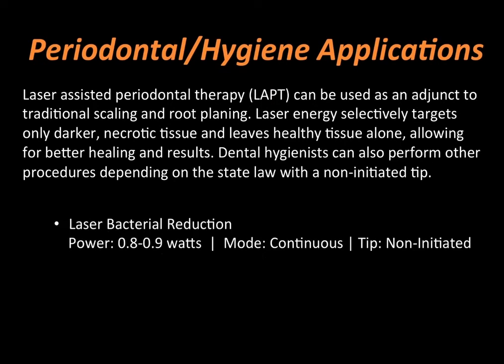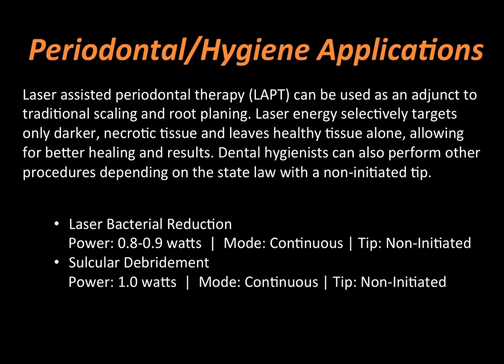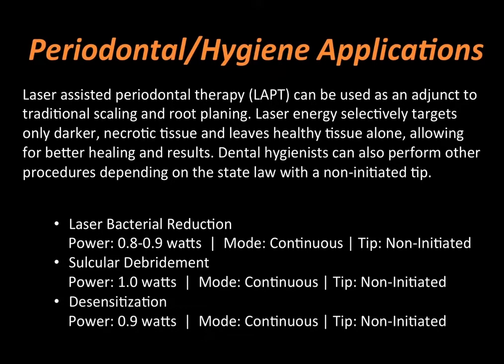For laser bacterial reduction, we'll decrease the power wattage and use a non-initiated tip. When we have a non-initiated tip, we're not cutting. We're simply kind of vaporizing. Sulcular debridement, we'll turn up the power and again, use it in a continuous mode with a non-initiated tip. And we can also use it for desensitization.